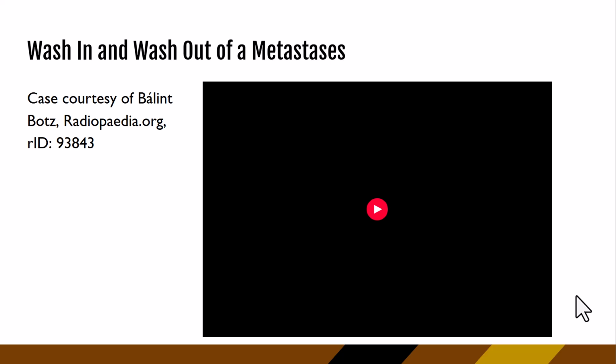And then these lesions you'll see are kind of hypoechoic to isoechoic, making them a little bit tricky to characterize on the grayscale alone. After they put in the Sonoview contrast, the lesions are going to show up really, really early and really intense. So that's hyperenhancement, especially compared to the surrounding liver tissue, which will eventually get the contrast enhancement. But the fact that those lesions hyperenhance so quickly, that's going to be a red flag for malignancy.